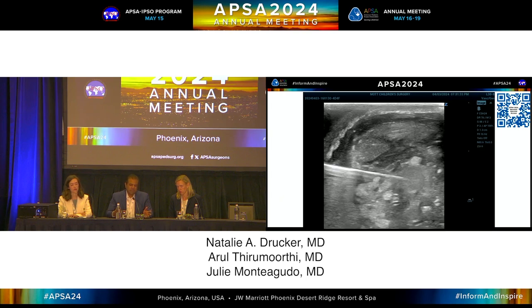Now you can see the tip of the needle in the IJ, but you don't actually know that you're fully in. There's tenting of the vein. You may see flash. Another thing I teach is never look at your needle, all right? Never look for flash, because you don't know if you're just through the endothelium and you're really well seated, because at this point you might think, oh, I have some flow, I can pass the wire.